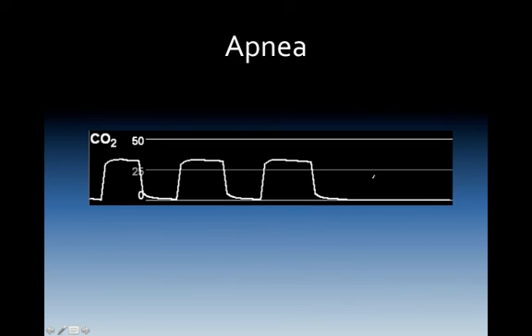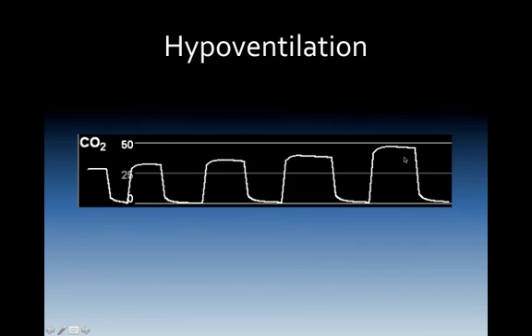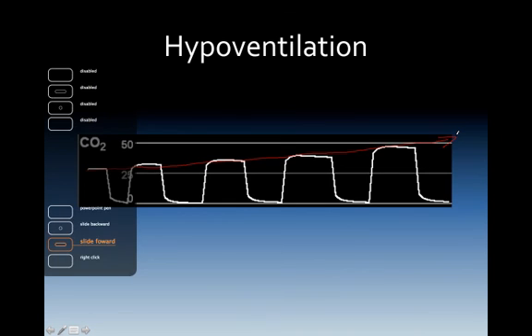This is apnea. Where did the wave go? This would be hypoventilation, which would be a steady climb and increase in capnography levels. Hypoventilation would be the number one cause of this.